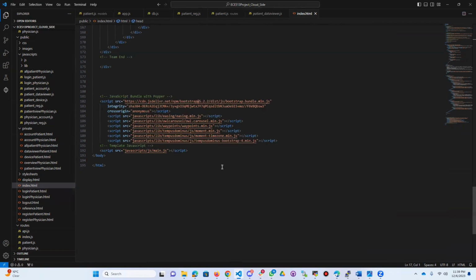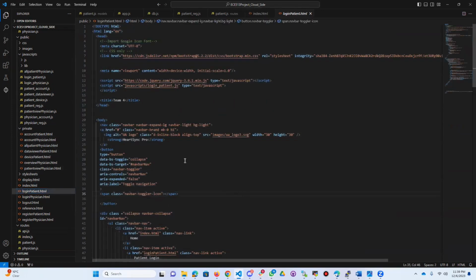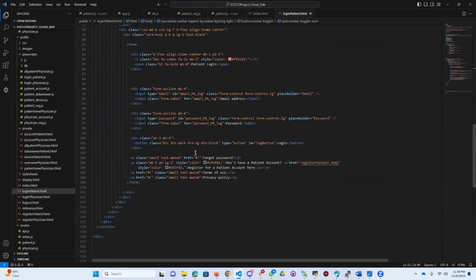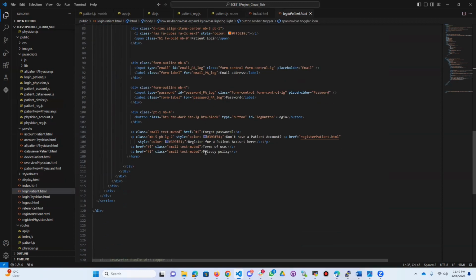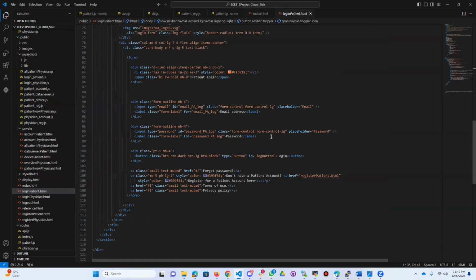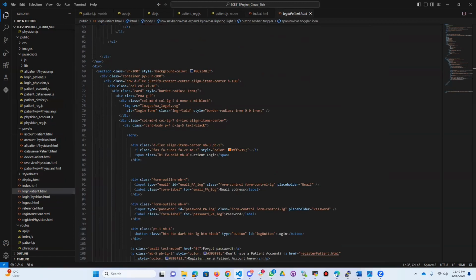And in the patient login, where is the login? Yeah, in the login page, here you can see the same things. The HTML document represents the login page for the patient section of the HeartSync Pro project. The page includes a navigation bar with links to, like you have seen, the home, patient login, physician login and reference, and features a well-designed login form with email and password, and it shows what to fill.